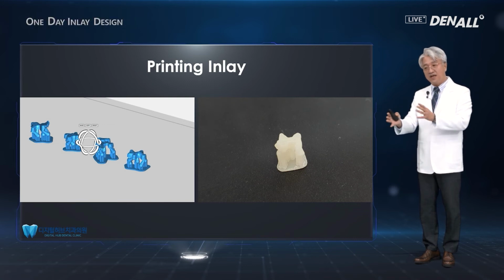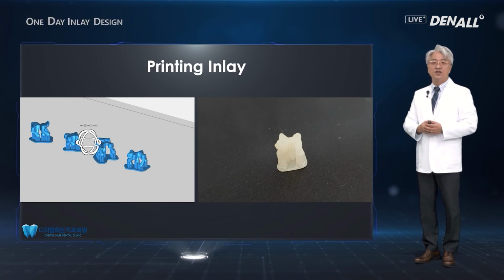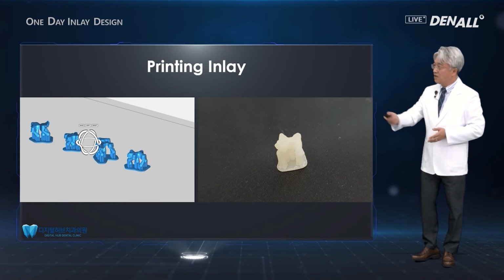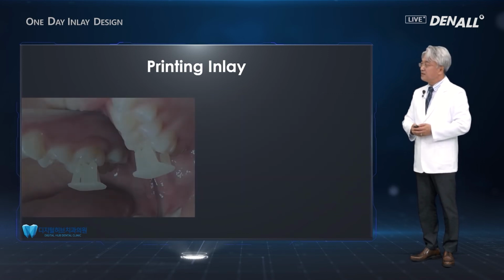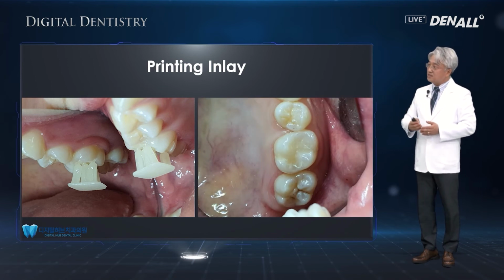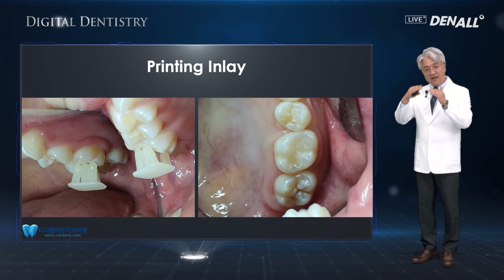So in making inlays with the one-day approach, if the patient needs to have many inlays, then one visit is sufficient to do all the work. So it's a very attractive option. So this is how the inlays were made. And this is how it was delivered into the mouth.